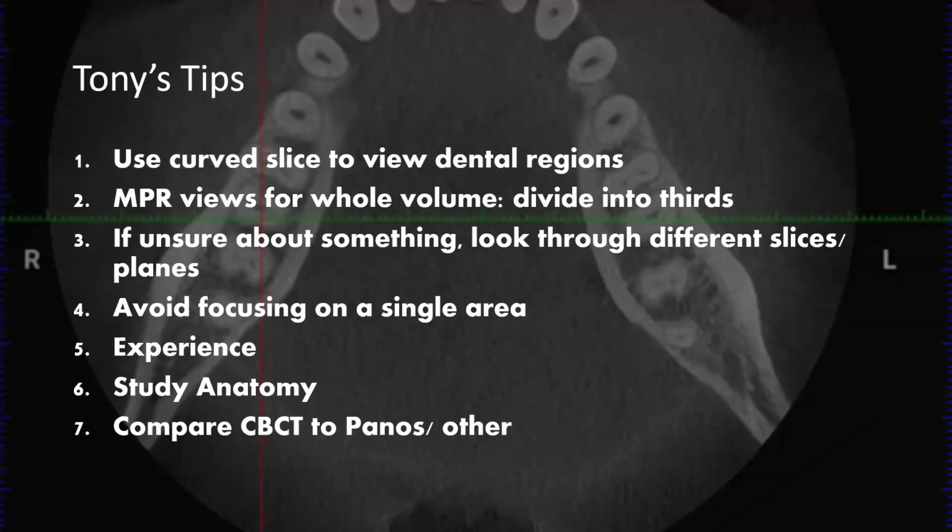I spend the bulk of my time looking at the teeth in most patients because dental disease is so common. That's the most common by far thing that I see, previously undiscovered periapical lesions. Maybe one of the other common things I see is, in older patients, arterial calcifications. That's a health risk, right? That's a cardiovascular risk, so they should be informed. They should have a consult unless they're already being treated for cardiovascular risks.